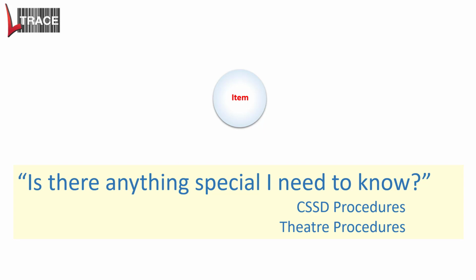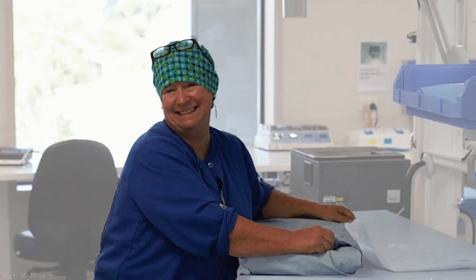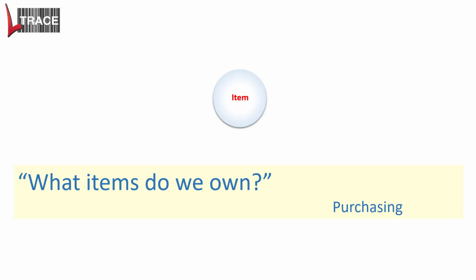So this is now looking at your CSSD procedures, but it could also be your theatre procedures. As someone's opening up an item in theatre, you can be telling them something specific that they need to be aware of. So it's not just in CSSD, it's all through the hospital. My big point here is if you've got a good tracking system, it should be moving you away from just focusing on the tracking system and allowing you to actually get on and do the job properly.